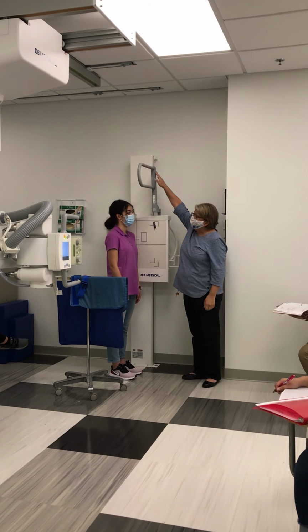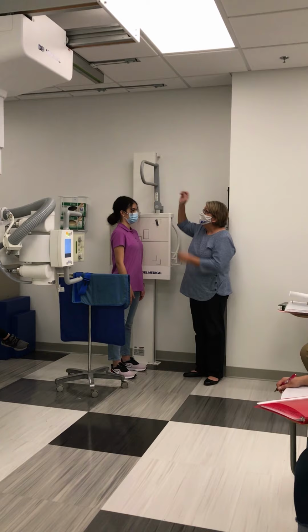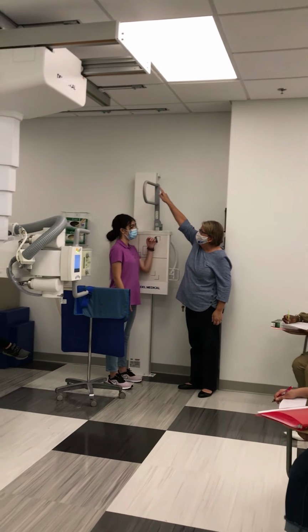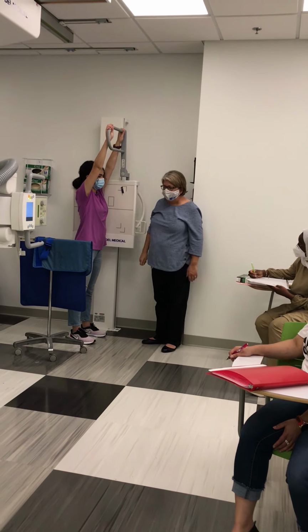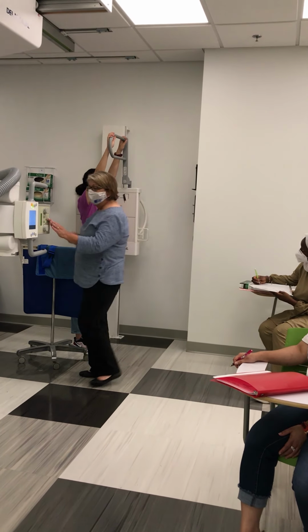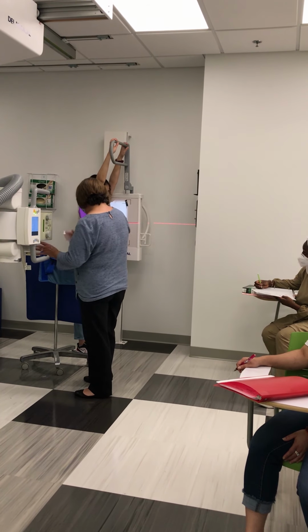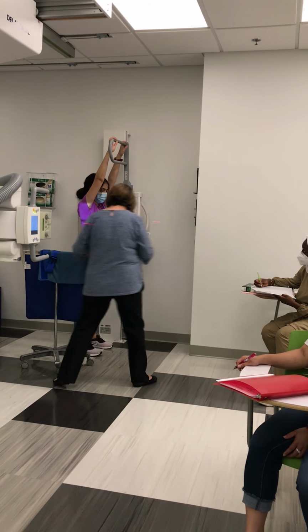I want you to stand with your feet shoulder width apart. Reach up and grab the top bar with both hands, like that. I'm still at 72 inches, this hasn't moved. Collimated to 14 by 17.